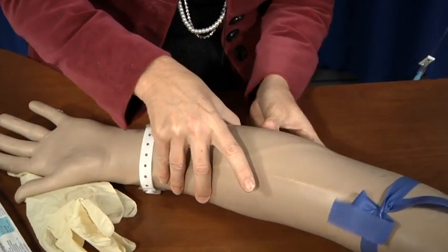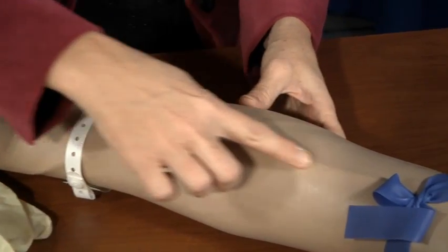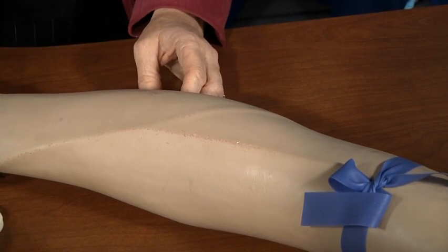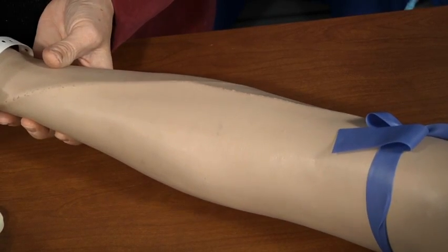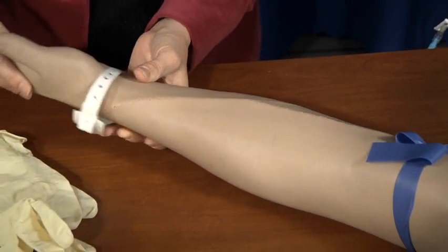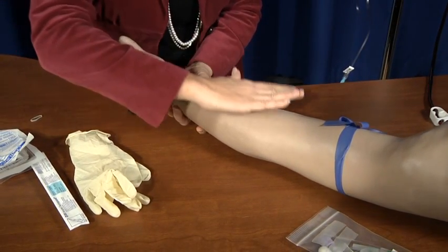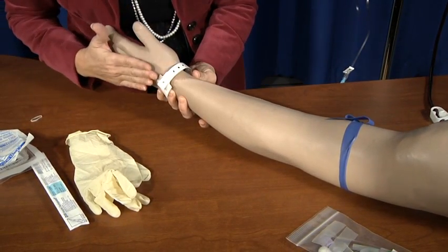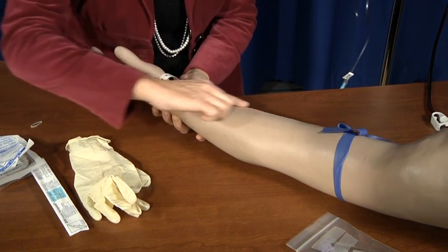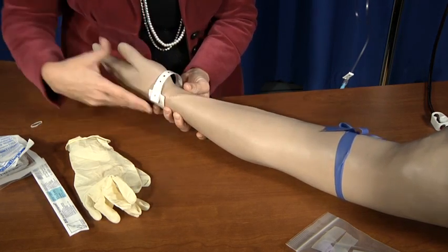You can see one here, and of course you can see one here. This is the most preferred. We want to start distally, and distally means the furthest from the body, and work our way proximally towards the body. The reason why we do that is we might miss. So if we miss up here, if we try to initiate it down here distally, we already have an injured vein, an injured vessel that this fluid now has to go through. So you want to start distally and work your way proximally.